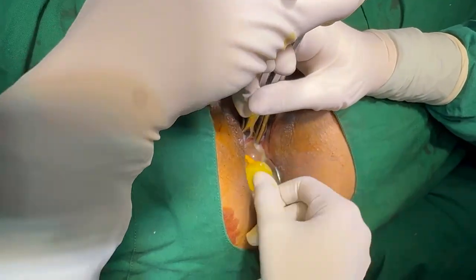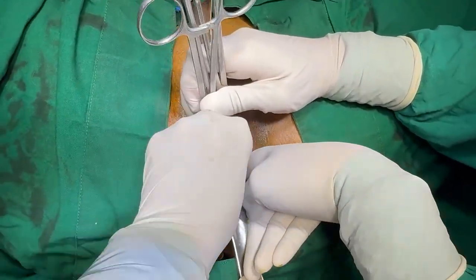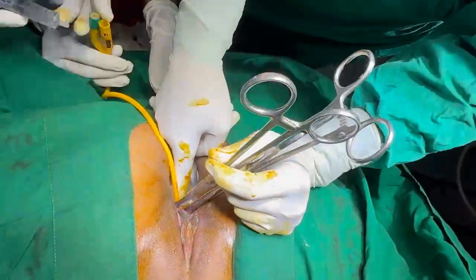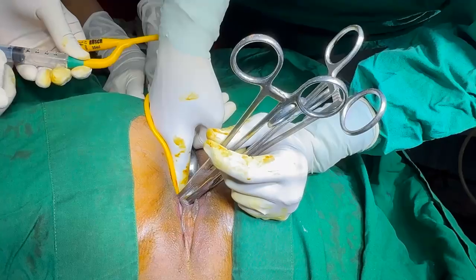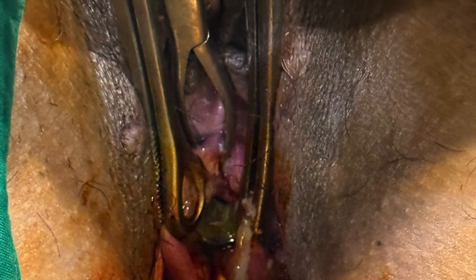Low spinal anesthesia was given in lateral position to avoid rupture of membranes, and in this case we planned for modified Shirodkar's encerclage, as the cervix was effaced and very short, and it was difficult to give McDonald's encerclage.